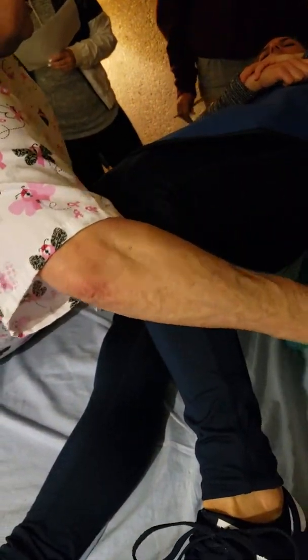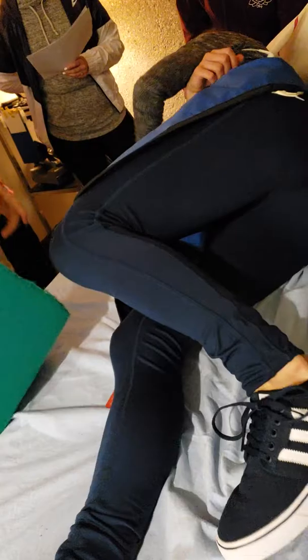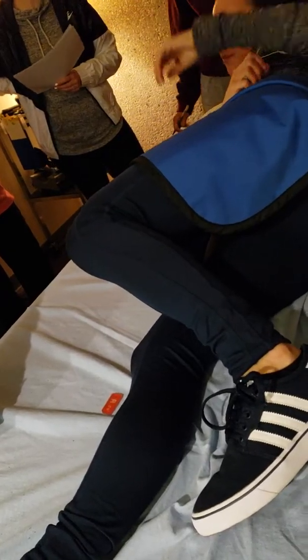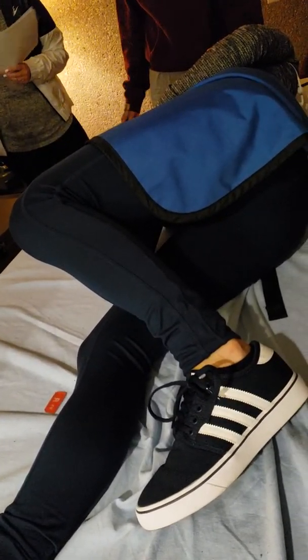So now you take this sponge and go ahead and turn all the way on your right side. Remember, when they're rolling like this, this is a wide table, but sometimes the tables aren't as wide, or the patient might be wider.